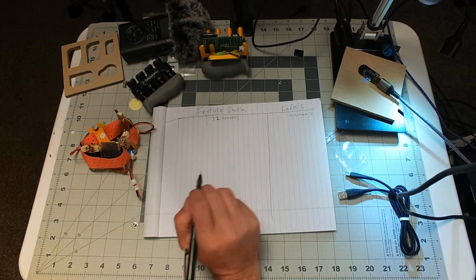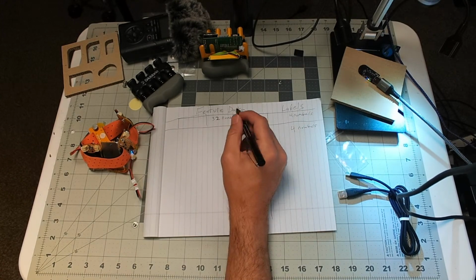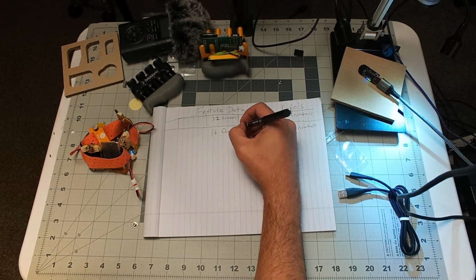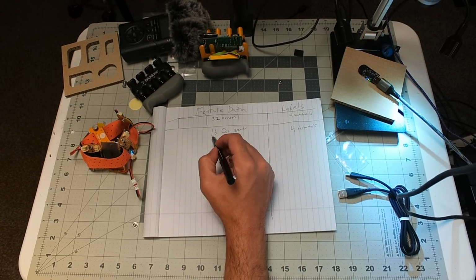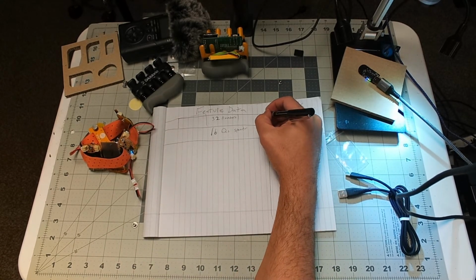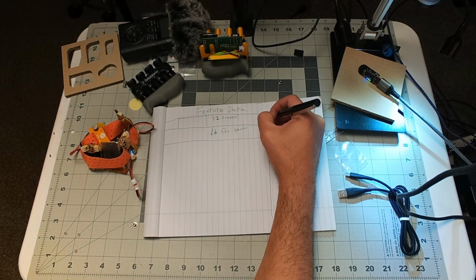We could try that. We're always going to have 4 numbers over here. It's our output. We could also send it the 16 data points, the spectre values, which I'm assuming have some kind of filter there. We could send the 16 and then try to match them here. But I like just the raw numbers, and we're actually going to have to add one. There's going to be an add one here, and this is going to be our time domain. TD, I don't know what to call it. Time domain.